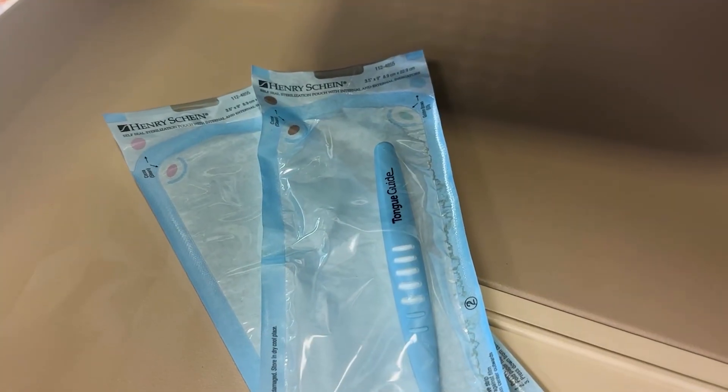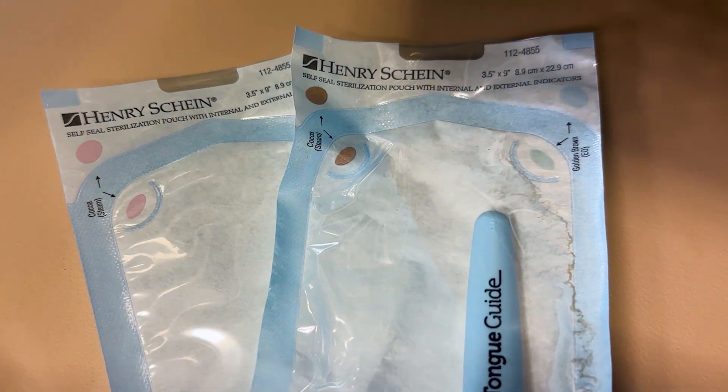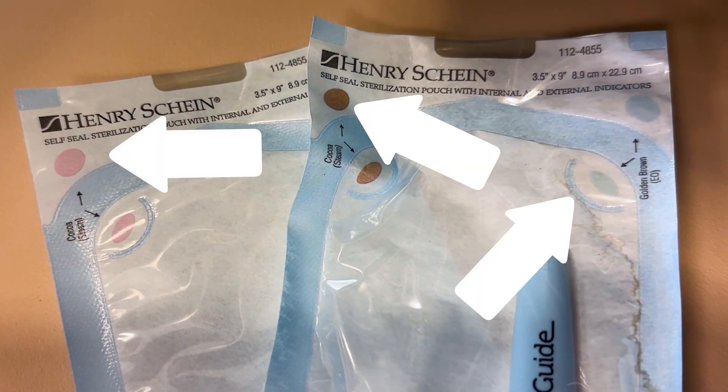For pouches, both the external and internal indicators are built into the design and can be seen from the plastic side of the pouch. These chemical indicators provide a visual confirmation that the package or pouch has been processed and that the sterilization cycle has met all necessary parameters.